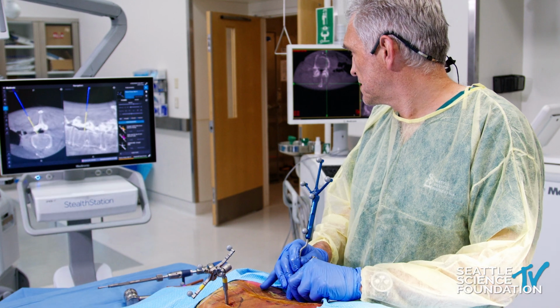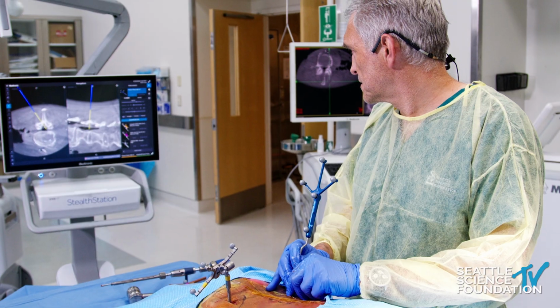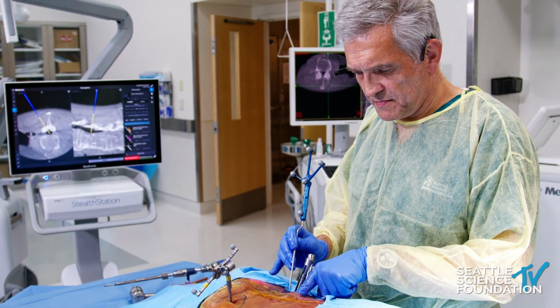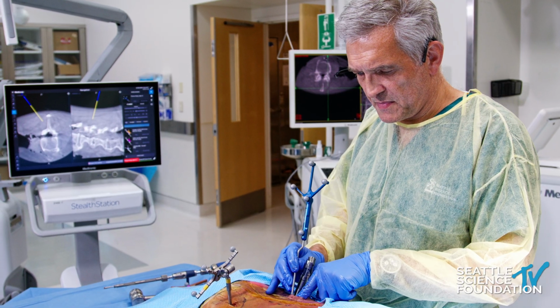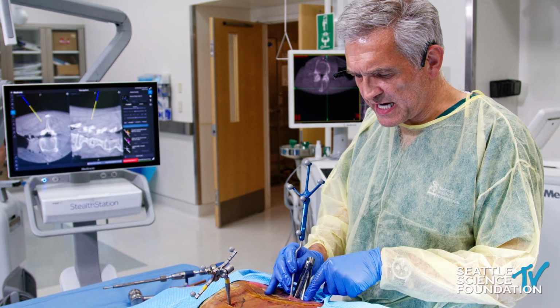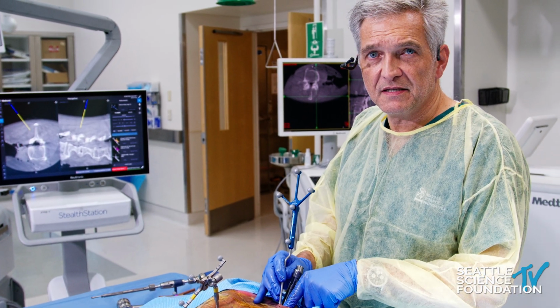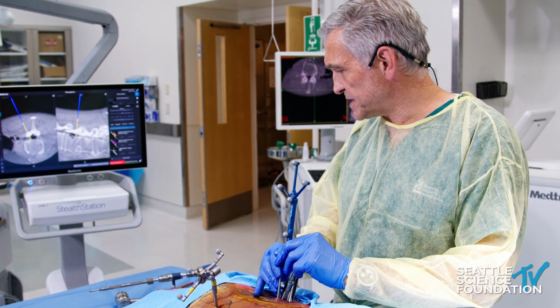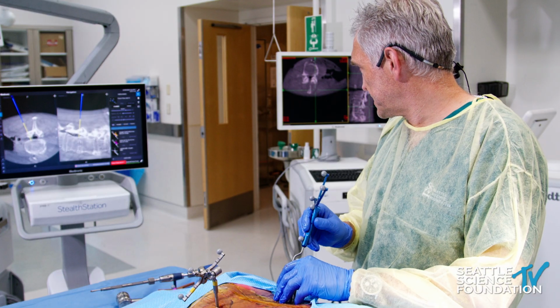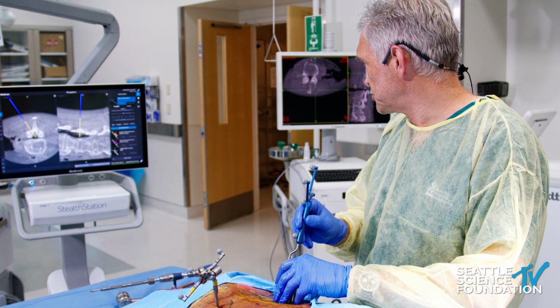So do you ever split the difference between where you want your T-lift incision in the fascia and the pedicle screws? I kind of look for pedicle screws, then T-lift, and then I split the difference with the incision and figure out where to go from there. Yeah, on this left side, I would make the skin incision a little bit more medial, because for that reason, that's true. So now this would be the entry point for the tube.